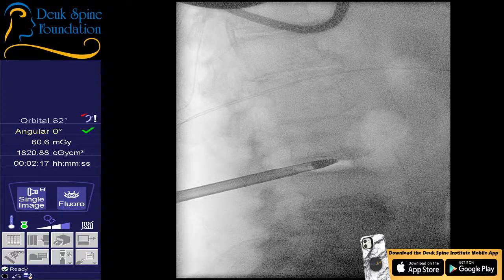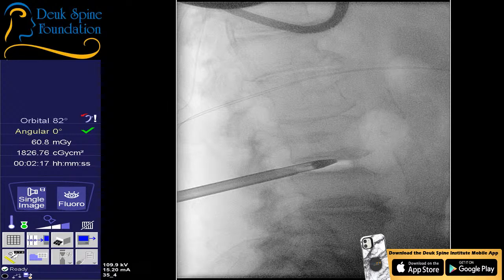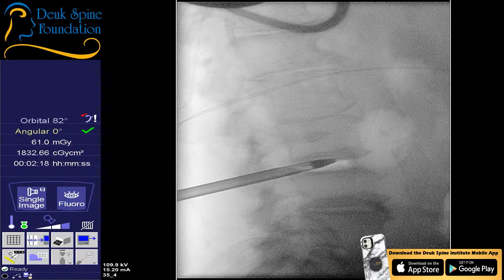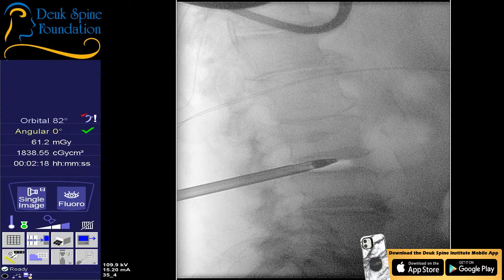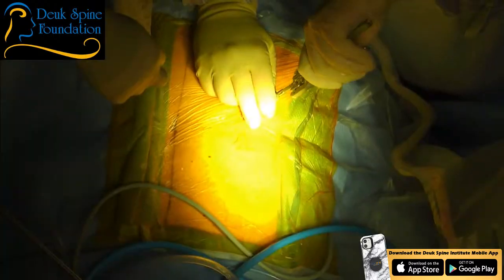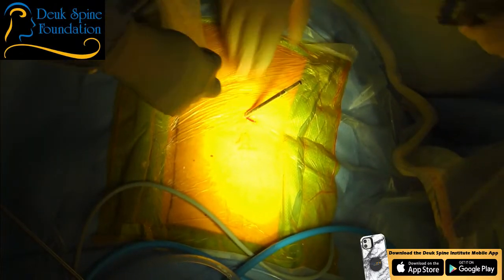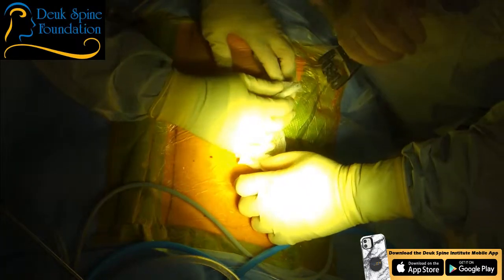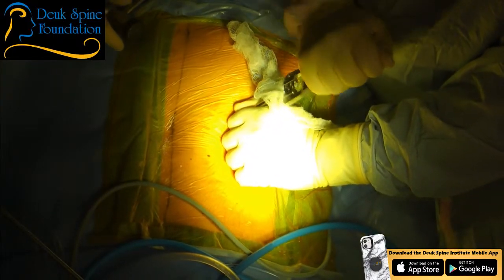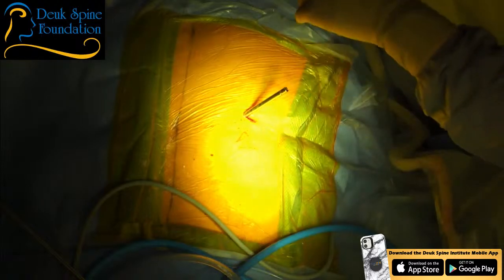So you have to do a decompression first. You have to unpinch the nerve. And unpinching the nerve doesn't mean just removing a bone spur or herniation. Unpinching the nerve is more complicated. It actually involves changing the entire structure of the disc from where it is preoperatively, where it may be collapsed, and the hole where the nerve comes out, called the neuroforamen, may be compromised, okay? And what that means is the hole where the nerve comes out may be narrow because the disc is collapsed. And so by reopening the disc, by putting in a spacer into the disc space, you basically distract the pedicles, which are the top and bottom of the foramen. You distract them apart, and you basically create more space for that nerve going out the foramen.